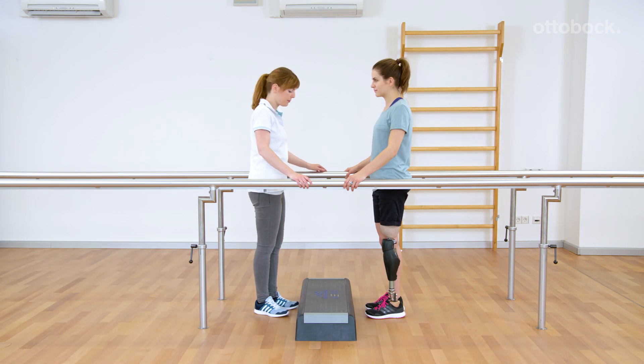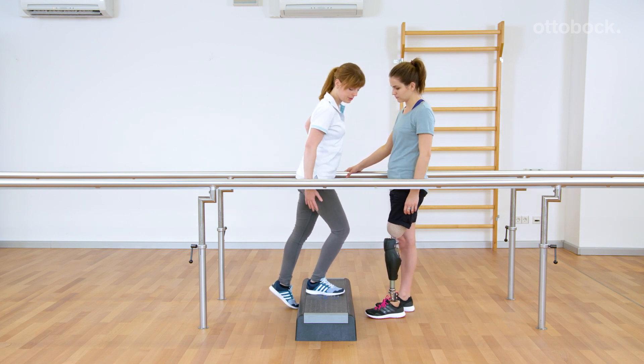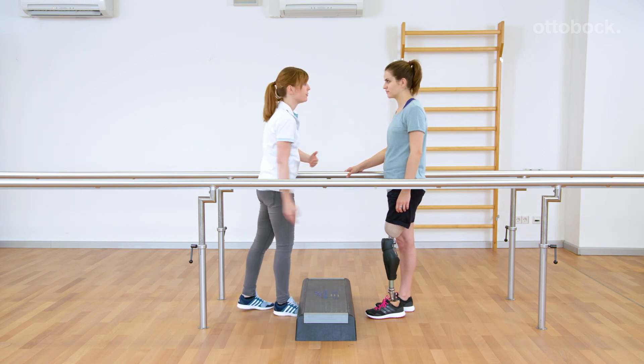After triggering the stairs function, placing the foot on the stair and loading the limb, the knee joint locks against flexion and supports stepping up to the next stair. A good socket fit is a prerequisite for using this function.